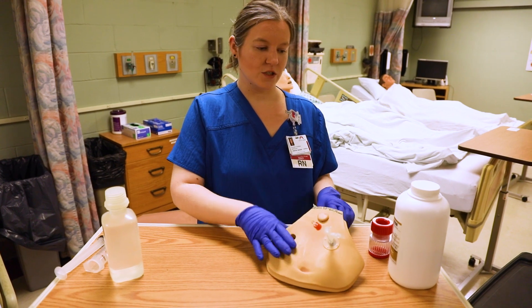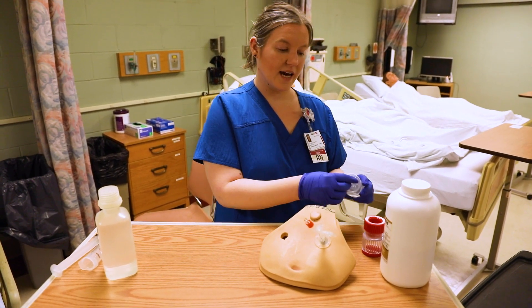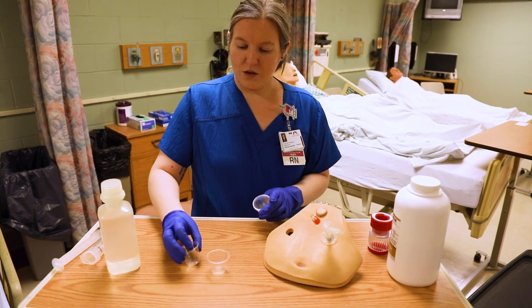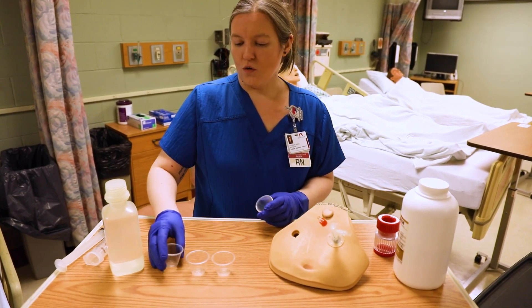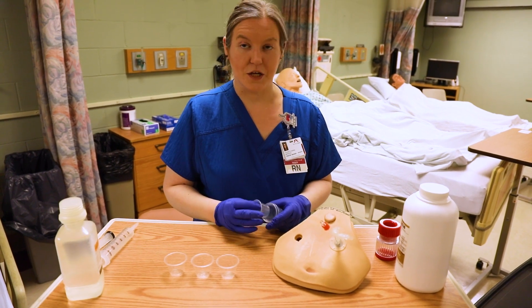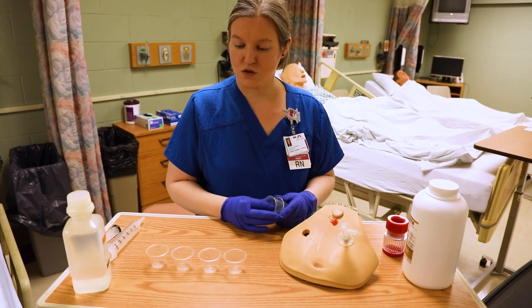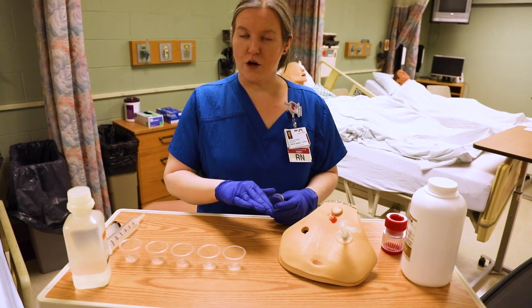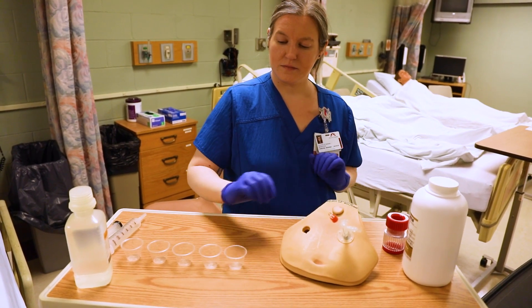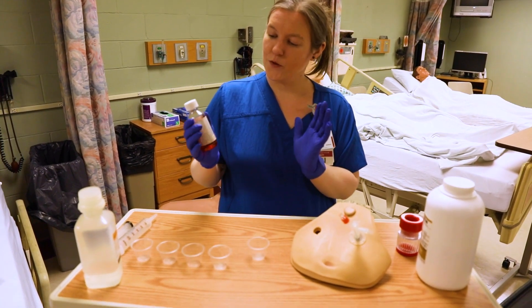For this video I'm going to assume the medications have already been checked and show you exactly how to administer them. As nurses, we don't know how every medicine is going to interact with each other, so it's best to put all the medications in separate little cups.